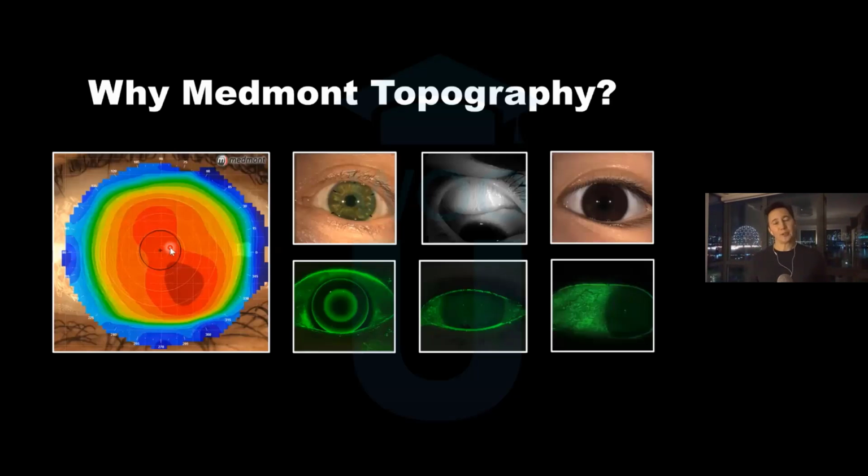Now, why the Medmont? Why use the Medmont Topographer with wave? Certainly the accuracy of the Medmont is sort of hard to argue. There's been so much data on using this instrument with specialty contact lens. It's been validated a bunch of different ways. Other topographers even use the Medmont to validate their own accuracy. So I think we can say the Medmont is a pretty good tool for building specialty lenses.